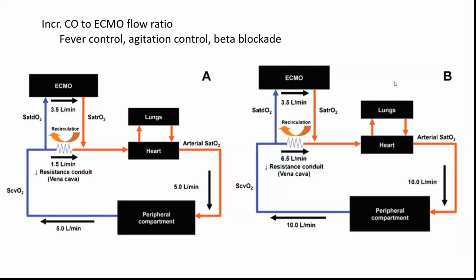So I want you guys to take a look at this. This is figure A. I'm going to break it down a little bit. This is normal, and this is figure B. This is not normal. So if anybody can take a shot at what's happening in these two figures in relation to the ECMO circuit.